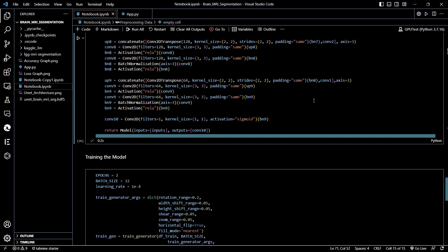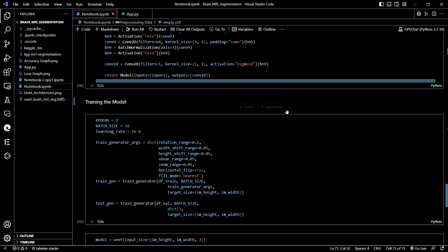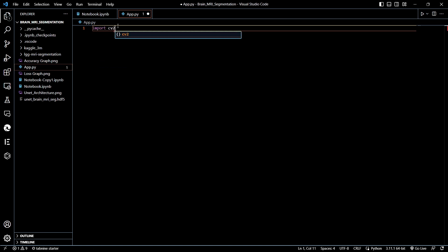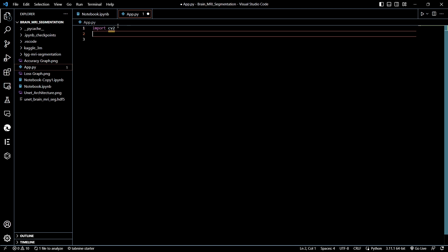We are going to direct our model to be used as an input and output generator, or as a full-fledged app. We have first created an app.py and then we are going to import our required libraries — CV2 and some other libraries as well.